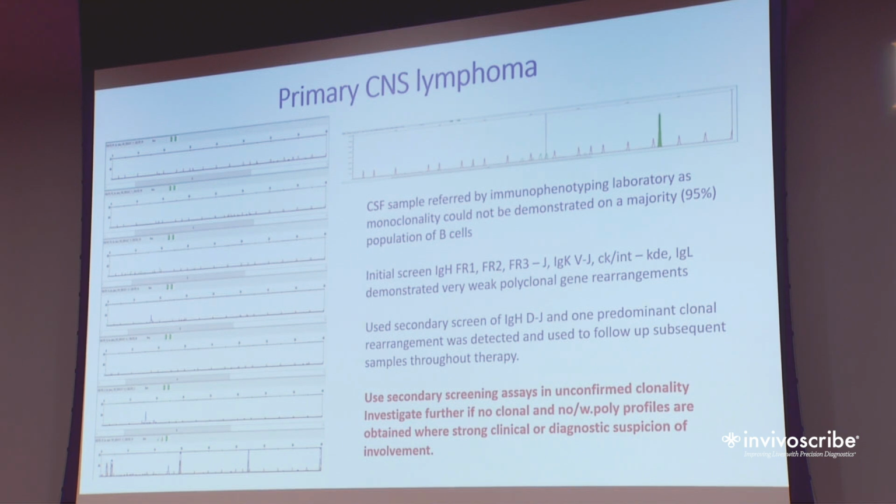These are very rare, and not coming up in all the assays because there's complementarity between all the assays, or two, that it's very highly mutated in all the primer sites, which is usual for heavy chains, not so usual on the light chains, or a combination of those two.